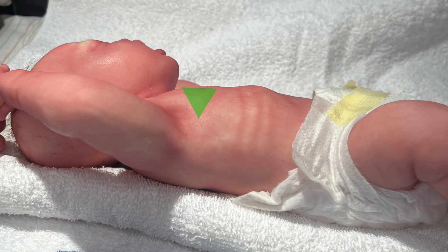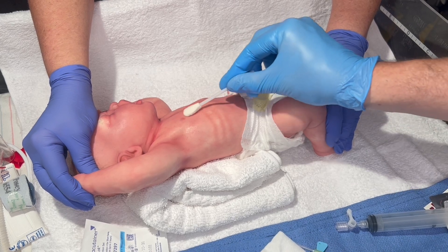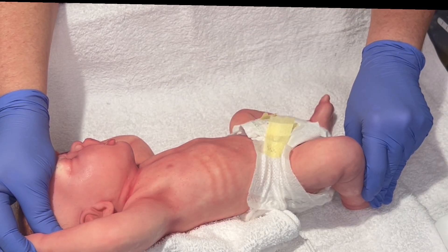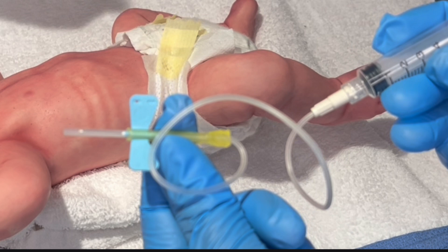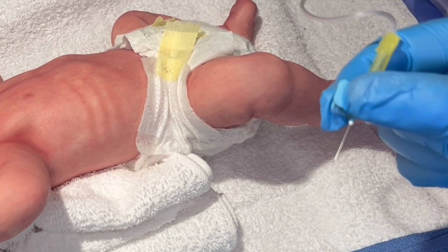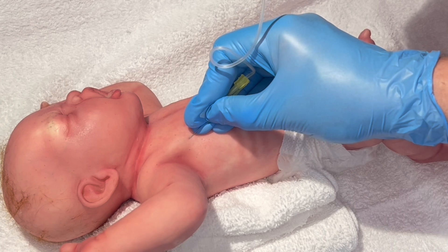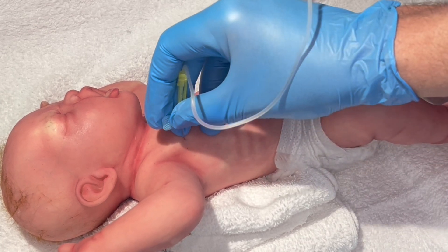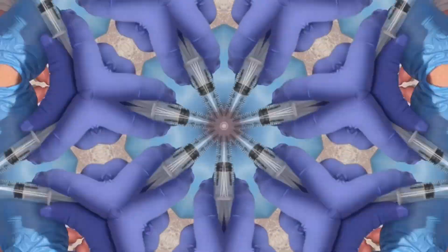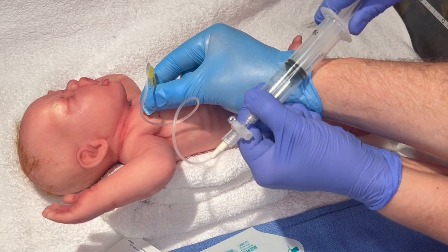Now we will demonstrate needle thoracentesis on the right side of the chest using the fourth intercostal space anterior axillary landmark. You begin by cleansing the site in a circular motion with a cleanser per unit protocol. Next, you take a gauze, wipe the site, and mark your landmark. Next, you'll take your butterfly and attach it to your 5-ml syringe. At this point, you can remove the cover from your butterfly and prepare for needle thoracentesis. Locating your landmark once again — fourth intercostal space anterior axillary — you'll enter the chest going over the top of the rib, pulling negative pressure on your syringe as you advance your needle. You'll stop advancing your needle once you have air in your syringe. At this point, remove the 5-ml syringe and replace with the 20-ml syringe attached to a three-way stopcock.